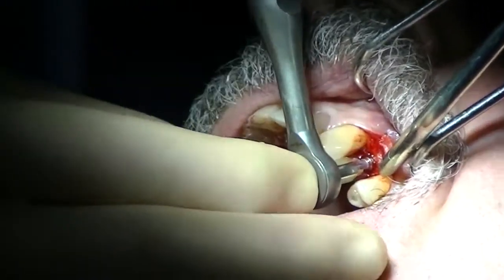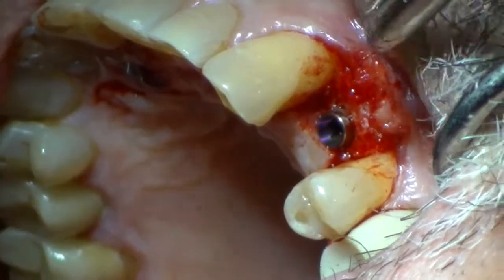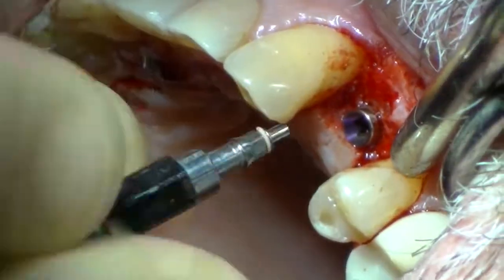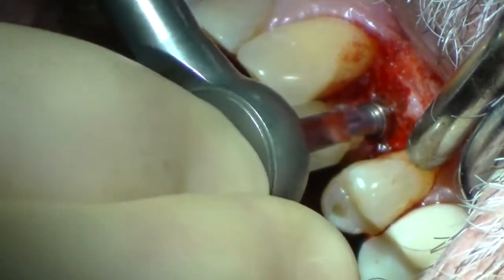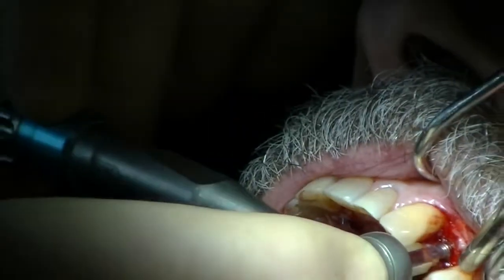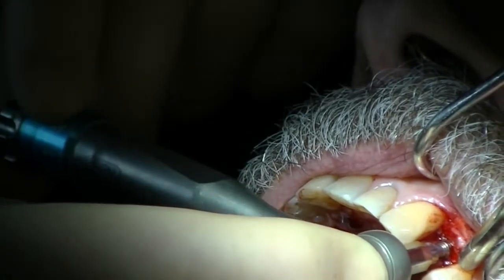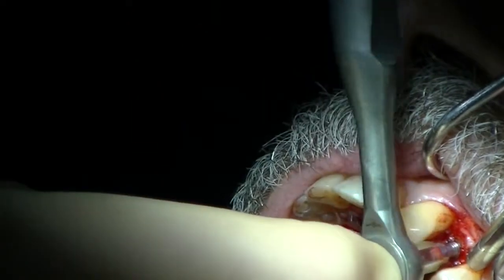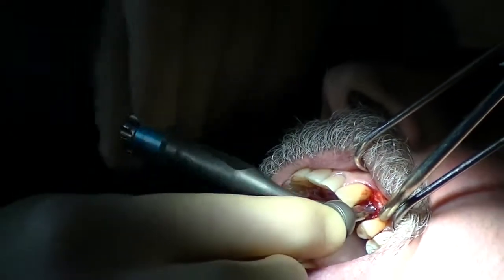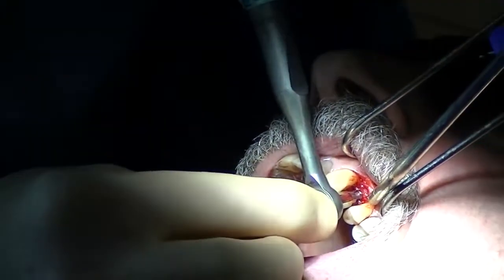And I'm looking at position, and you can do this radiographically. I still have a little bit more to go, another millimeter. Remember, 4/4 turns is about a millimeter, so if I do 4/4 turns, I should be right on, if my math is correct. Here I'm going 9 o'clock, 12 o'clock, 9 o'clock, 12 o'clock, 9 o'clock, 12, and it clicked.